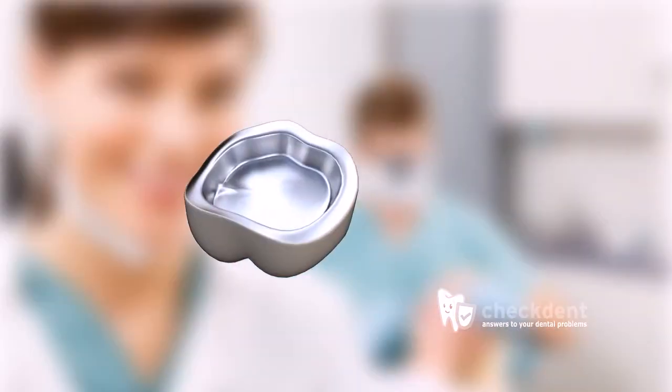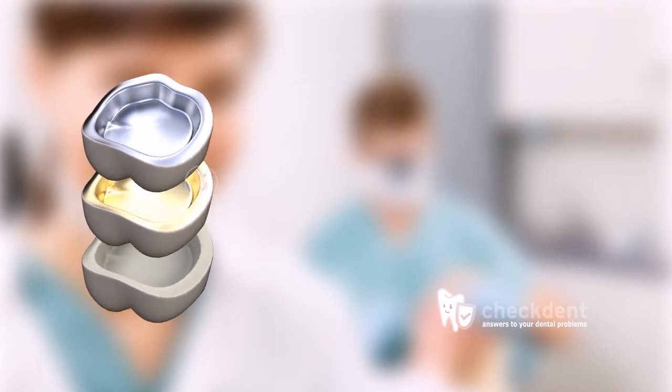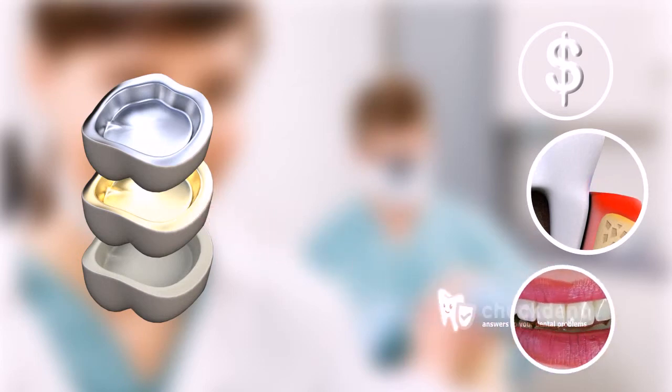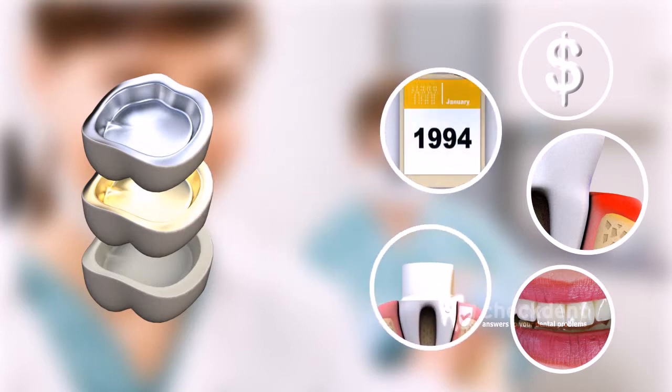Although many other factors contribute to a good crown, the working methods described here clearly show why the quality and price can vary so much. A good crown does not cause inflammation or recession of the gingiva. It is indistinguishable from the original tooth and lasts for decades. Even if it needs to be replaced, the underlying tooth stump will always be in good shape.